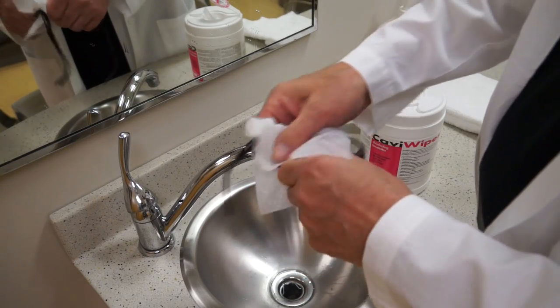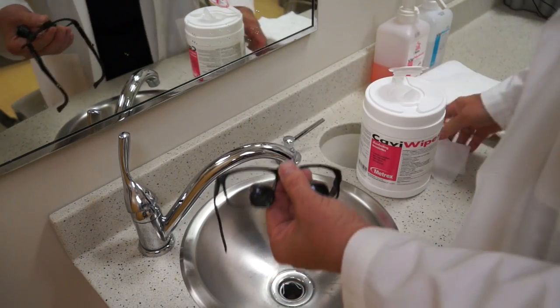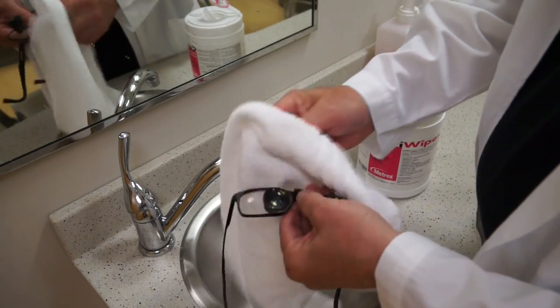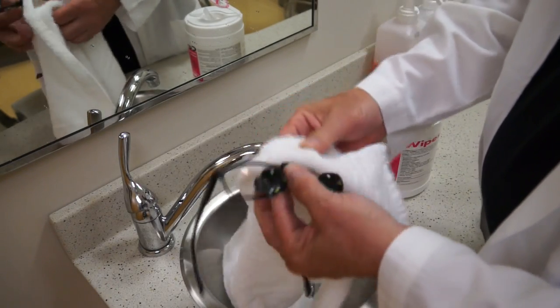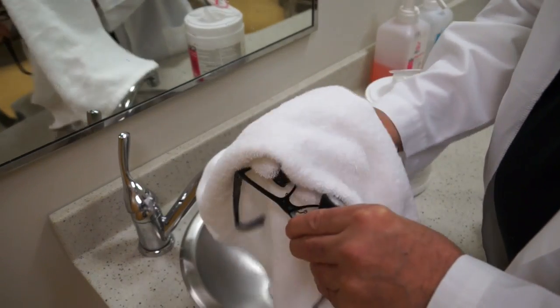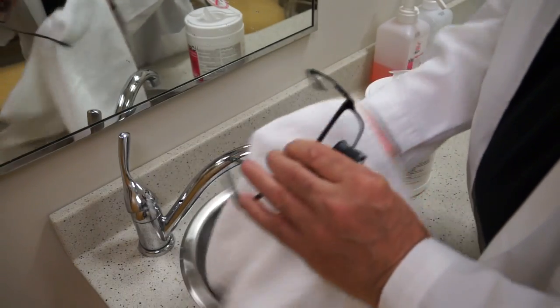Once you've wiped that down real well, take a soft cloth and wipe off the excess fluid. Make sure that you get all of the surfaces, including the temples.